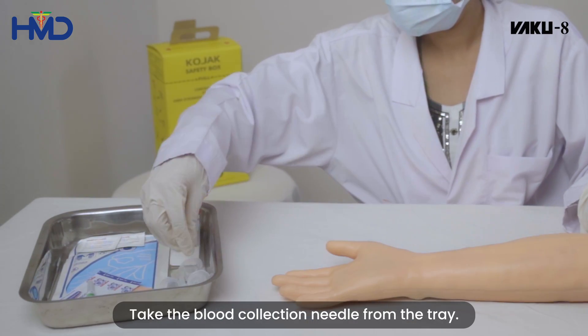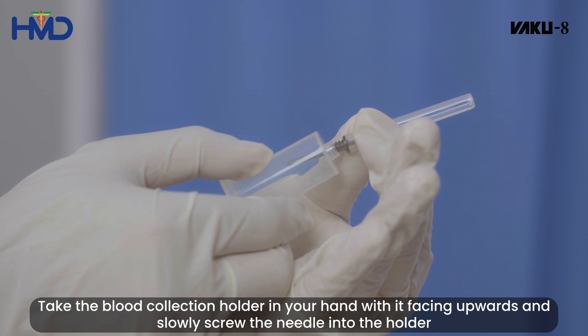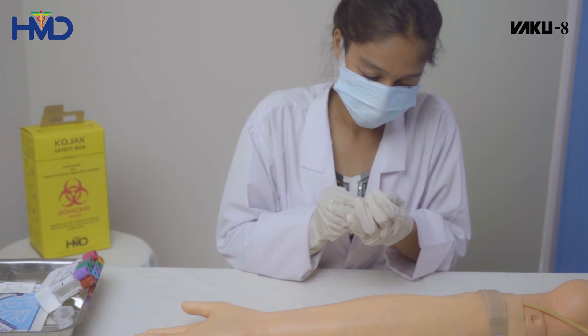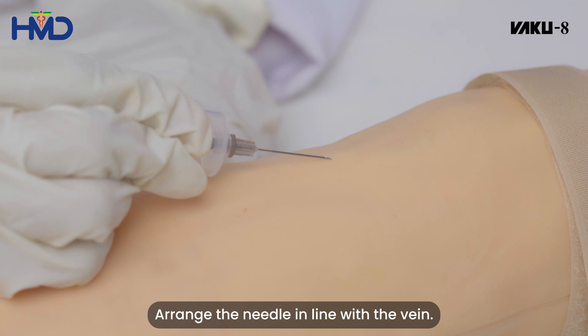Take the blood collection needle from the tray. Take the blood collection holder in your hand and slowly screw the needle into the holder. Remove the top cover of the blood collection needle and arrange the needle in line with the vein.